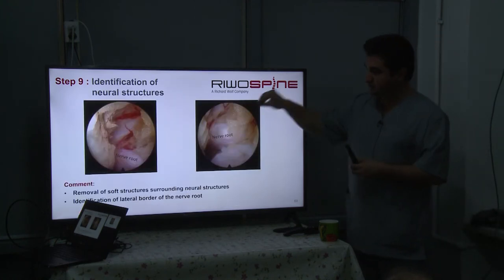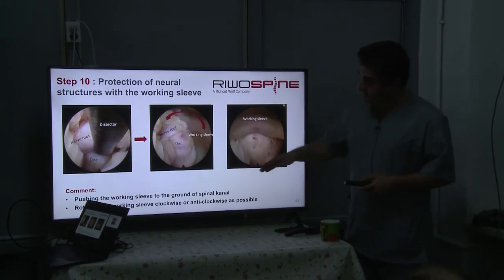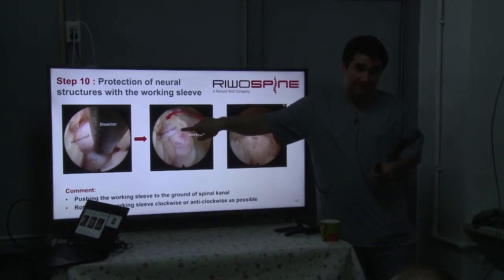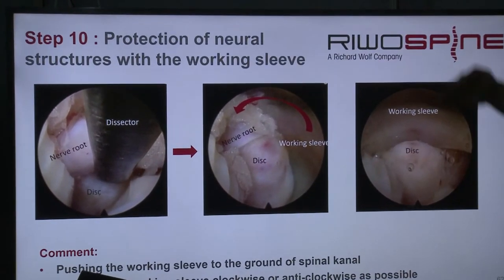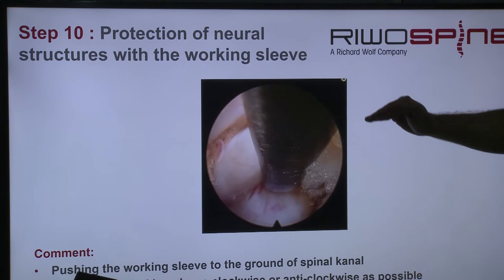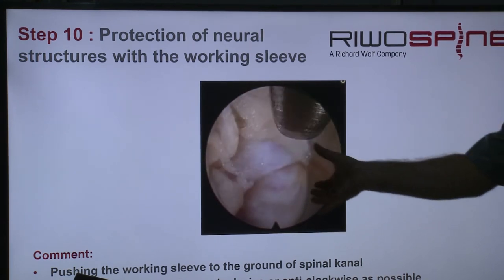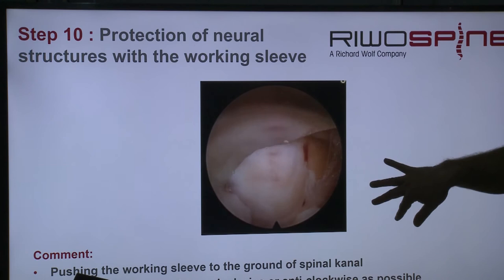Then what we do, we remove the fat tissues and try to find the root here. And then we retract the root and press the sleeve down. Then rotate the sleeve clockwise or counterclockwise. Both are available here. Then we protect the nerve root behind. How we do it? We retract the root to the medial here. Then press the cannula down. And always we keep the eyes on the edge, not to squeeze it, and rotate it. Then we rotate it.